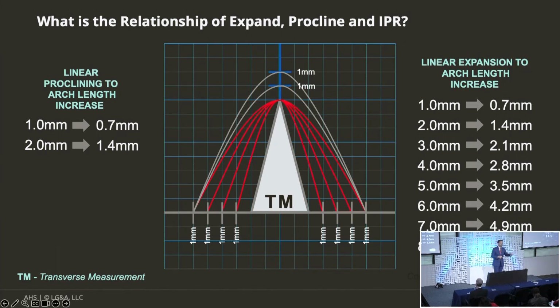So let's say you open up a treatment plan and you're getting maybe 2 millimeters of IPR total, or 2.5, or 3 millimeters, or 3.5. You know, if you had 0.5 in 6 spots, you'd have 3 millimeters total. If you had 0.5 IPR in 7 spots, you'd have 3.5. So think about what's your average amount of IPR. The last bunch of cases you've treated, what would be the average of the IPR you're doing?